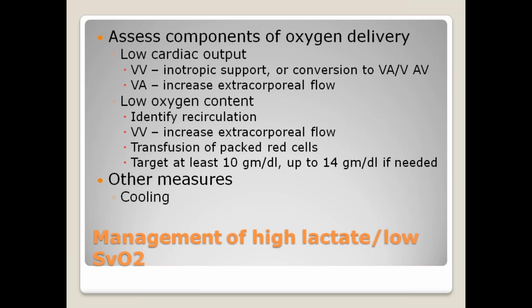Low oxygen content: the output is okay, but oxygenation is low, hypoxia. One of the causes I am going to discuss separately. In VV ECMO, it is going to be recirculation. If it is recirculation, you manage the recirculation, which I'll be discussing now. If the flow is less, we increase the extracorporeal flow, because in VV ECMO, whatever we say is that if the patient is hypoxic, you keep on increasing the blood flow.